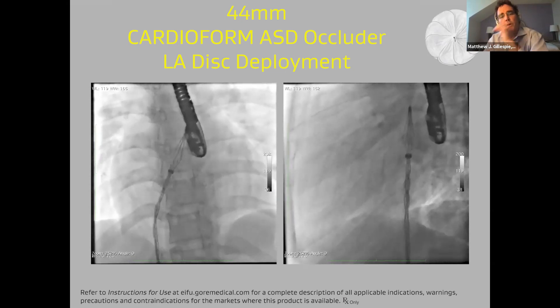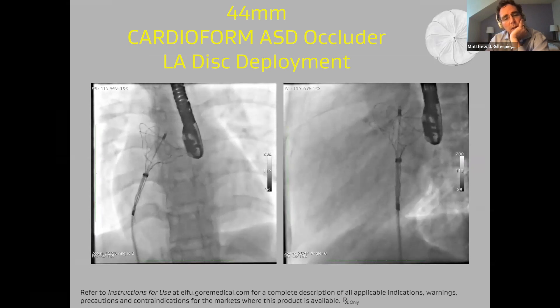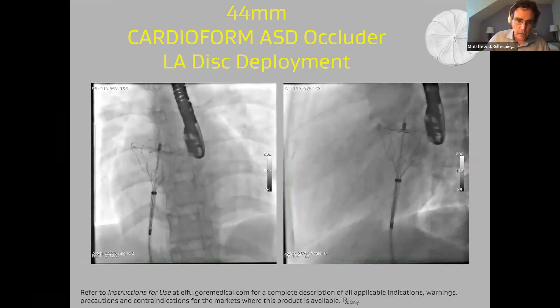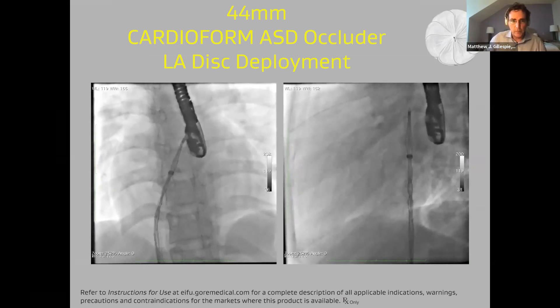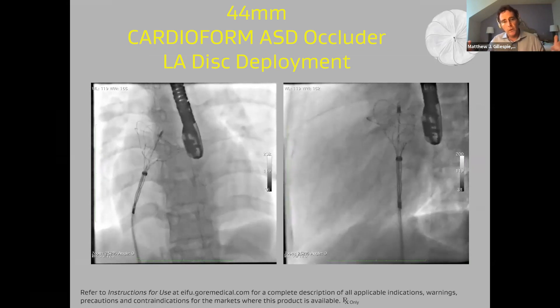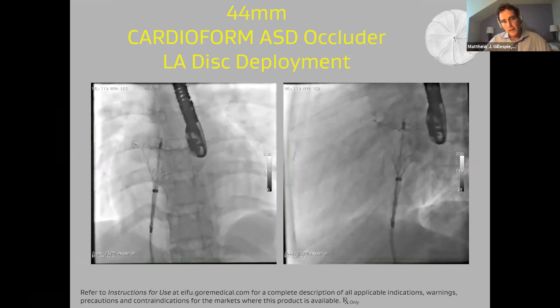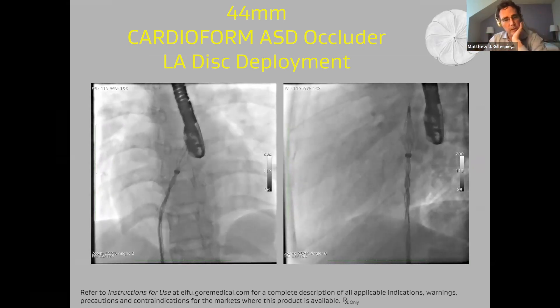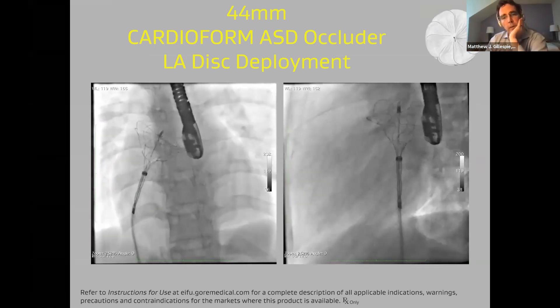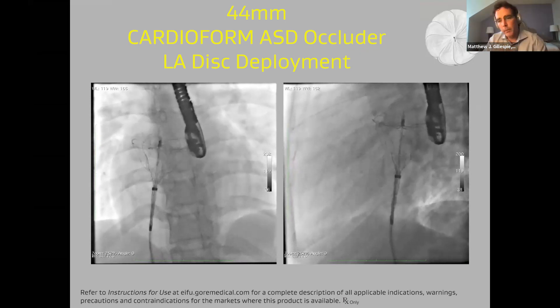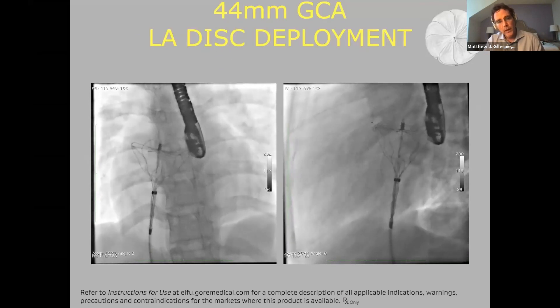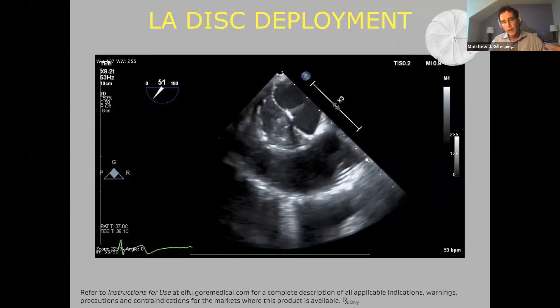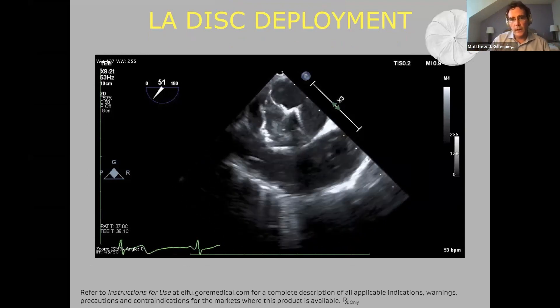Here's the LA disc deployment in a LAO cranial view on the left panel and straight lateral on the right. As you form the LA disc, you get tactile feedback on the handle that tells you when you've reached maximum LA disc deployment — you can feel it in the handle and see it on fluoro. You can see the wide LA disc, flat at the distal end, tapering down to the beginning of the RA disc with the waist bunched up. You want to open the LA disc, pull it up against the atrial septum, and there is tactile feedback you can feel. This is what that looks like by TEE — the LA disc completely full, pulling it back against the atrial septum.